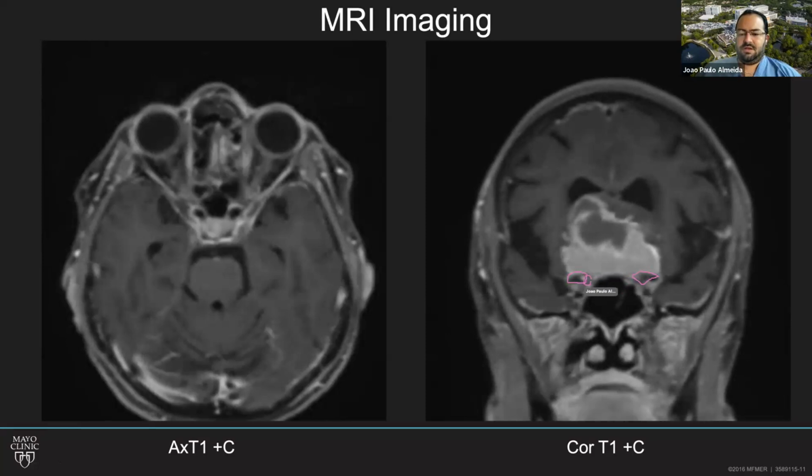So the anterior clinoid process is located superior and lateral to the optic canals. You're gonna see it better in the next sequence, not in this one exactly. And then you have therefore that this tumor is extending above and lateral to the optic canal into the anterior clinoid process and extending superiorly and laterally to that. So if the tumor extends lateral to the optic canal plane and the optic carotid plane, usually this is not a tumor that will be a great fit for endoscopic endonasal approaches.